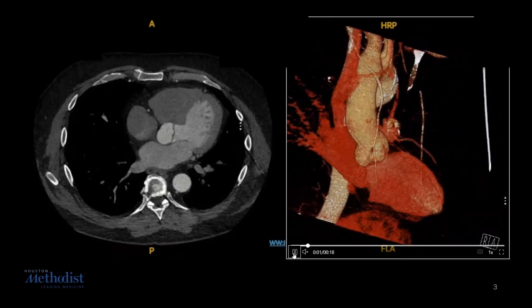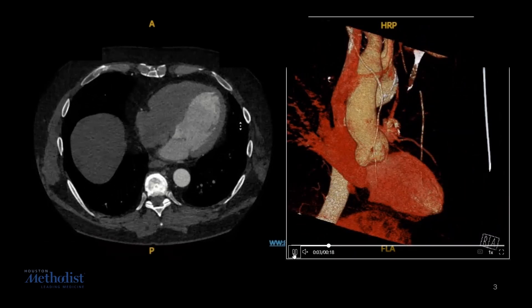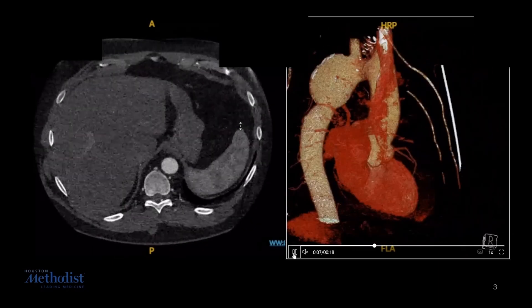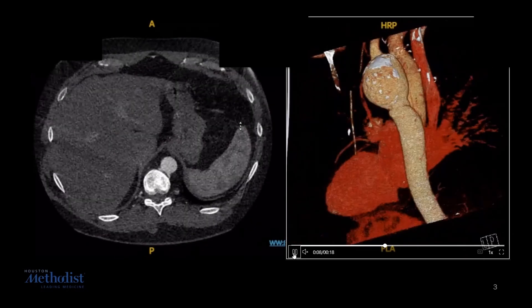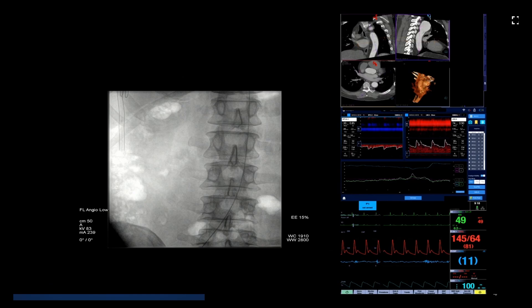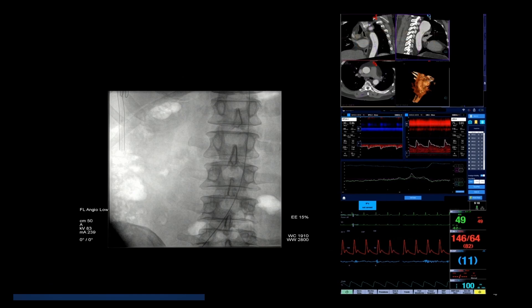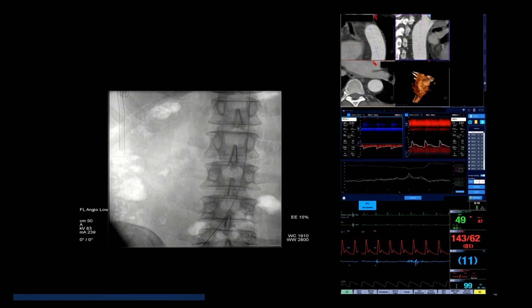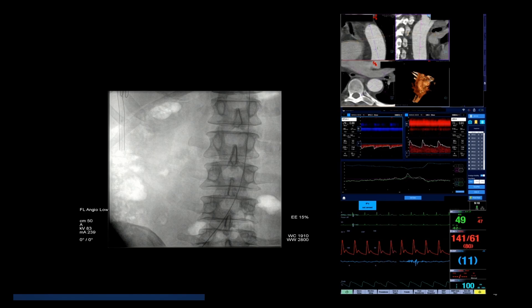You can see a 3D reconstruction of the CT on the right. TCD is the only intraoperative monitoring method that provides real-time information about the extent of embolization into the brain from the aortic arch during endovascular procedures. High-intensity transient signals, or HITS, suggest air and particulate emboli flowing through the monitored vessels.